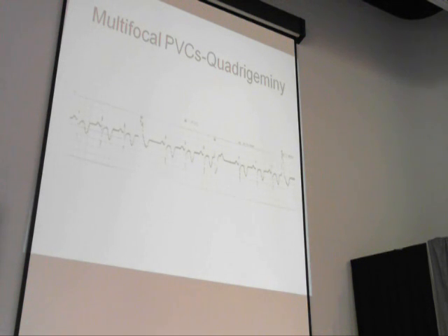But because those pacemaker cells are there, if you add some irritability or ischemia anywhere on the ventricles, left or right, there can be excitability because of the irritability. So you may notice the patient clicking along in normal QRST, and all of a sudden you see this large, funny-looking thing.